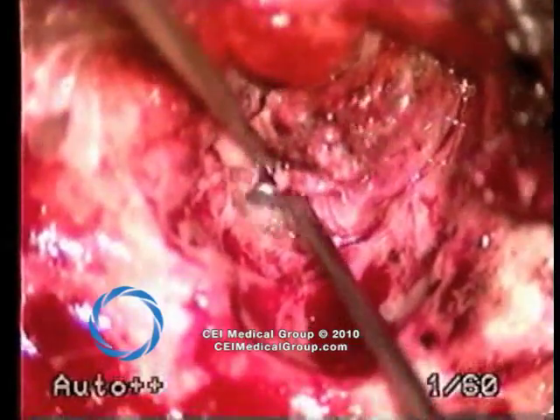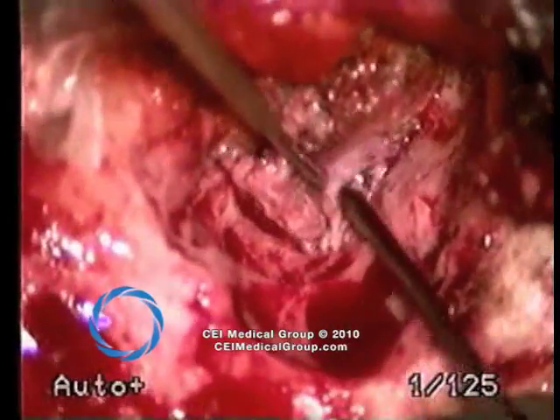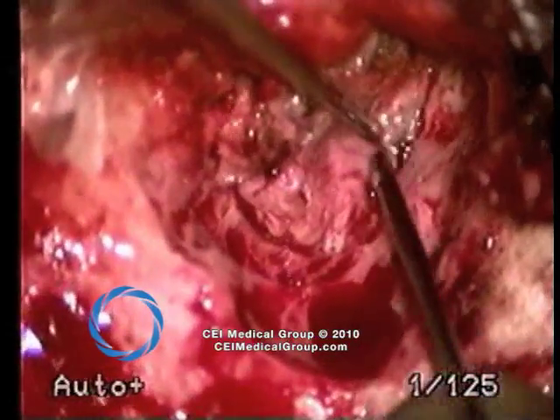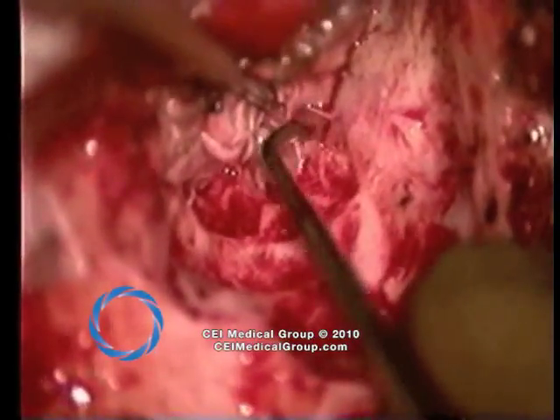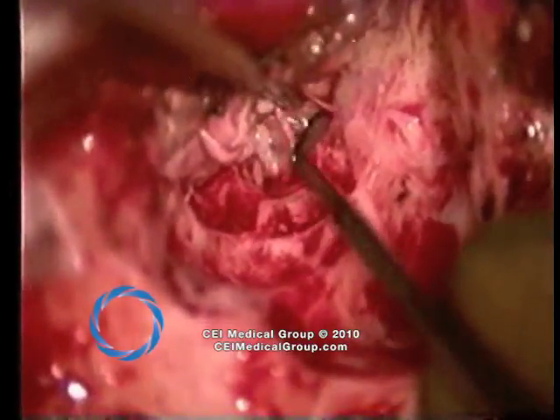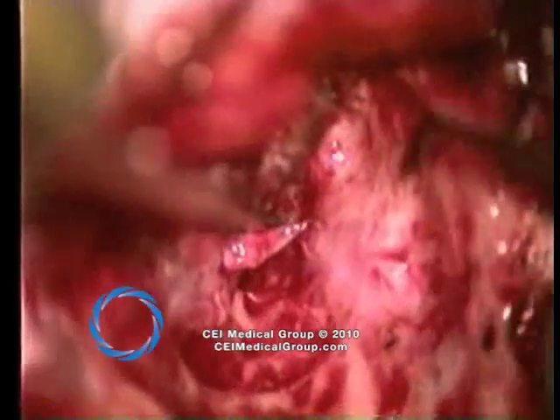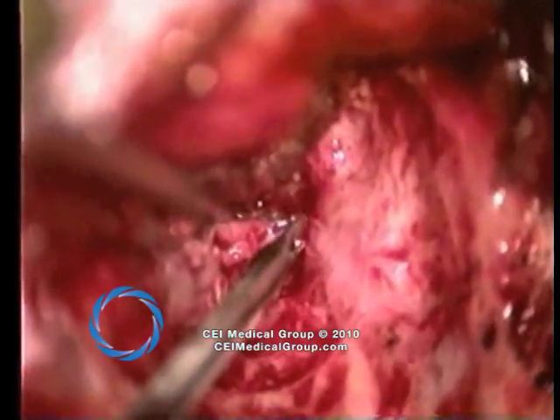As the dissection is carried further forward, the surgeon anticipates a potential facial nerve dehiscence, or as seen in this instance, exposure of the dura. The instrument here is touching the dura and is seen compressing it. Bone pate will be placed directly against the dura in order to reconstruct this dehiscence. Extreme care is taken to remove skin, preventing damage to the dura and resultant CSF leak.